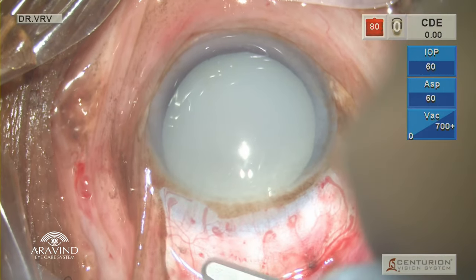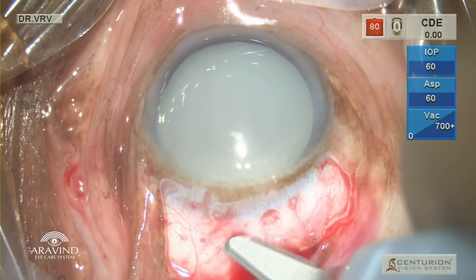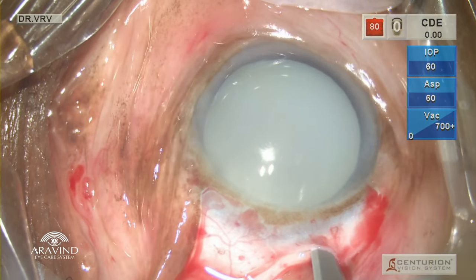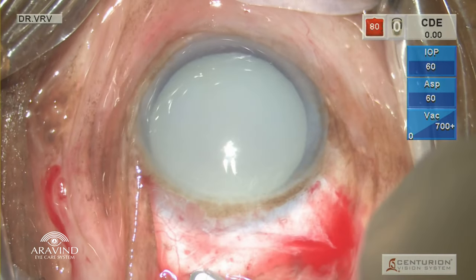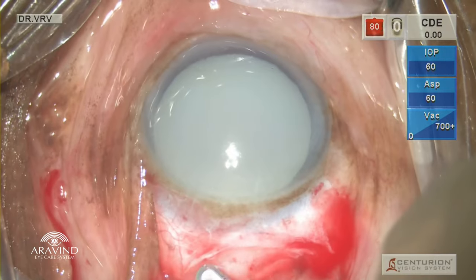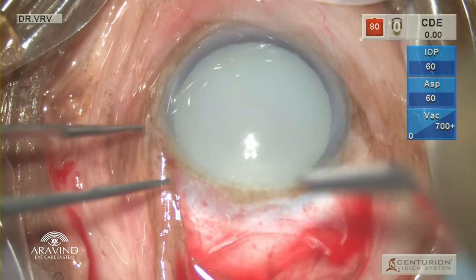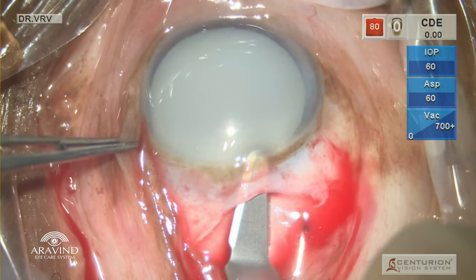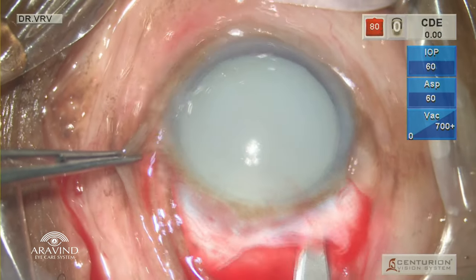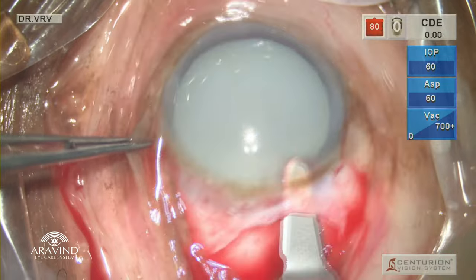Using a bevel of crescent blade, a frown incision is made to a size of around 8 to 9 millimeters. The main reason behind doing a large incision: one, we do not know how large the nucleus is. Once the incision is made, the crescent is placed on the left end of the tunnel and it is swiped unidirectionally towards the right a couple of times to create a plane.